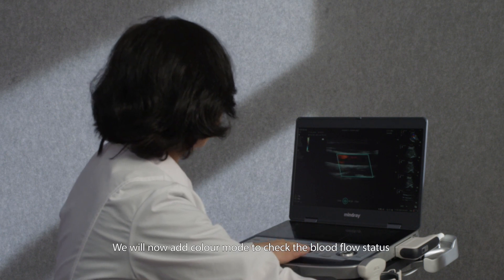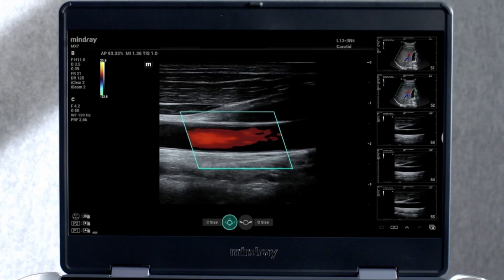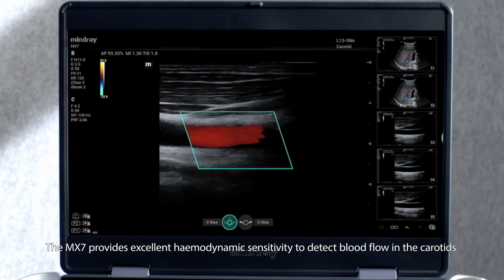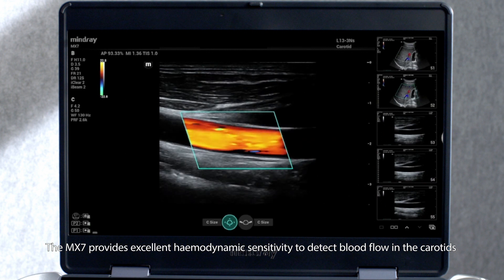We will now add colour mode to check the blood flow status. The MX-7 provides excellent haemodynamic sensitivity to detect blood flow in the carotids.